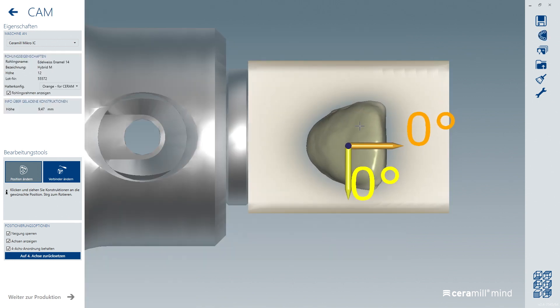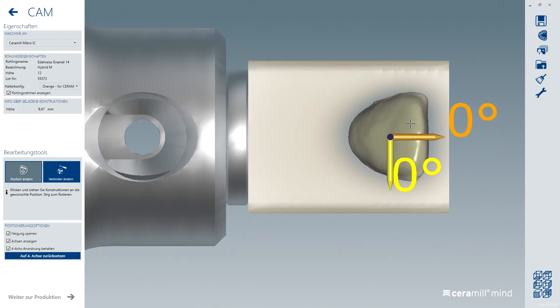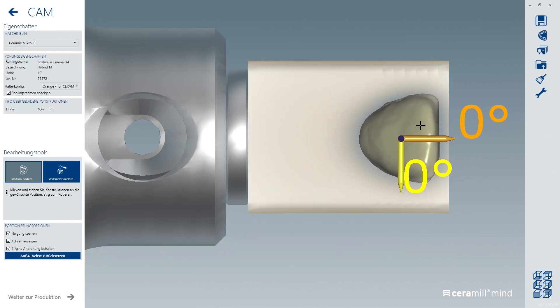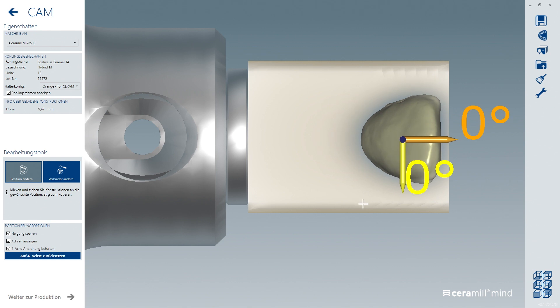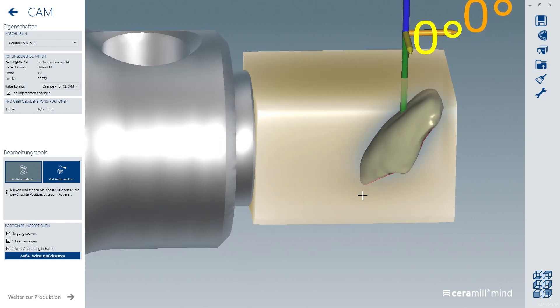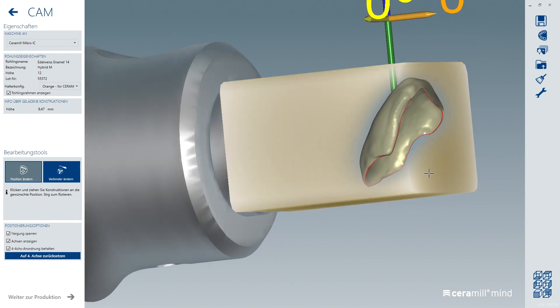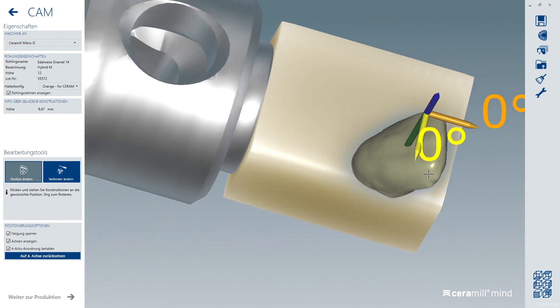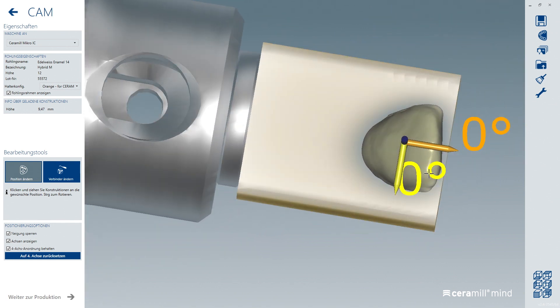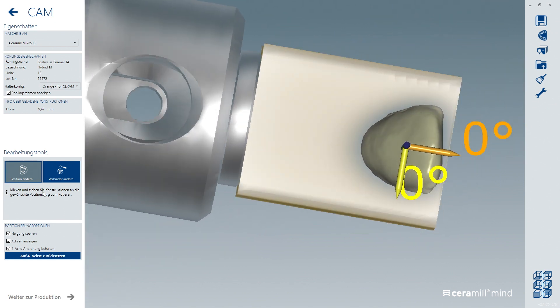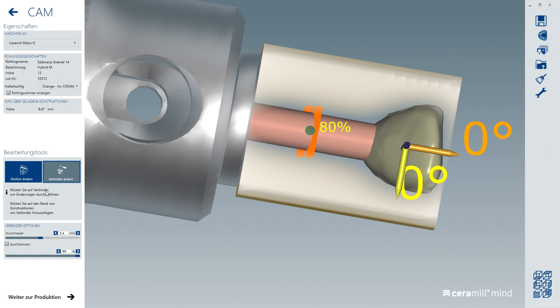If possible, position your construction close to the edge of the block to shorten the milling time. A diameter of 3 mm is sufficient for the connector.